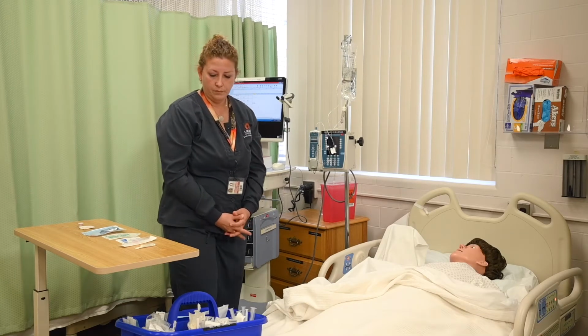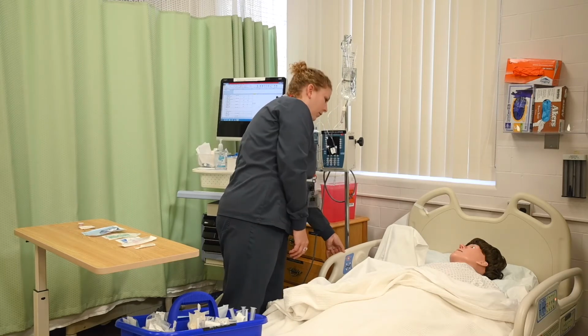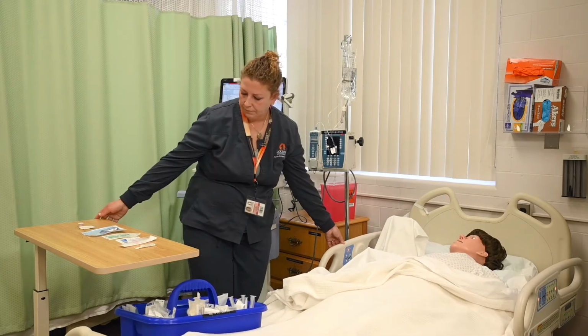Raise the bed to a comfortable working height and help the patient to a comfortable position. Also provide adequate lighting.